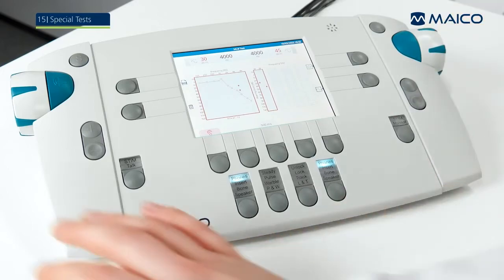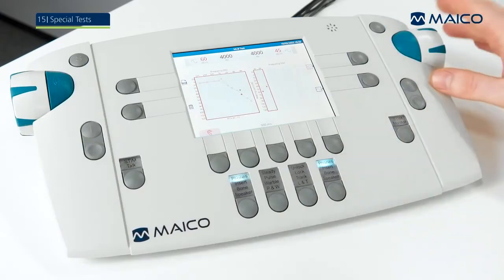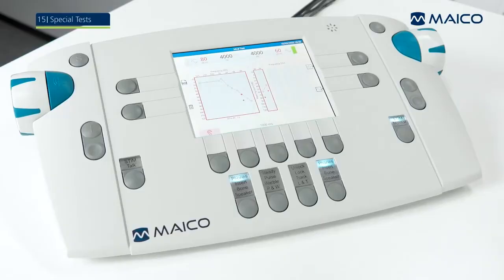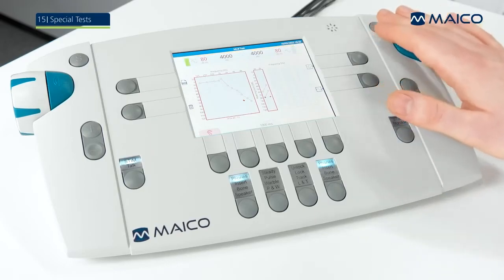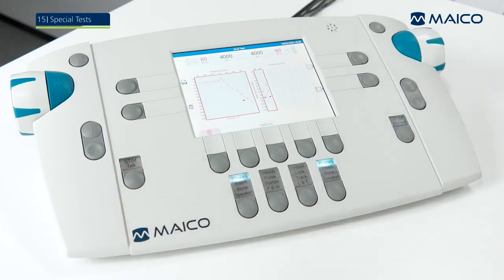The duration of the presentation can be selected between 500 and 1000 milliseconds. Then increase the level in 5 dB steps until the patient indicates that the loudness of both frequencies is perceived as equal. Use Store to save the measurement points and repeat the measurement until complete loudness equalization is achieved. To stop the test, end the tone presentation as usual with the stim button.